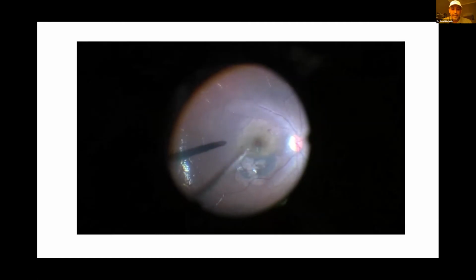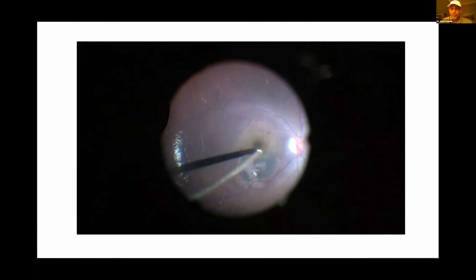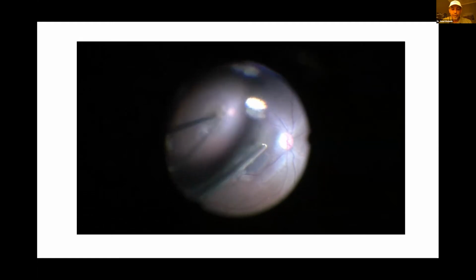And then what you do, I'm going to do this in a second, you get your cutter and you try to trim it. Now, I learned this the hard way. When you're doing this, please lower your vacuum, because if you don't lower your vacuum, you run the risk of detaching the whole ILM. And unfortunately, it happened to me before. If you use high vacuum when you're trying to trim these edges of ILM, then the vacuum will just suck the whole ILM into the tip of the cutter, and you will just detach. So you lower your vacuum, and then I did air fluid exchange, which went very smooth.